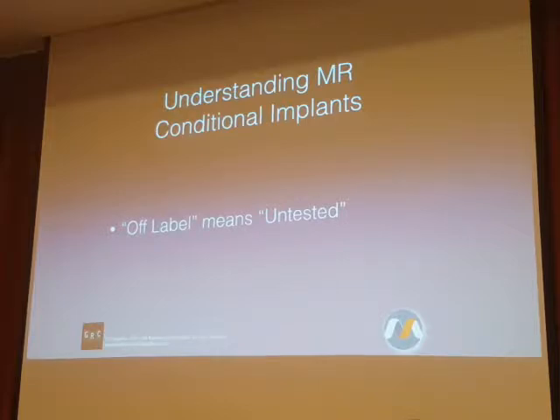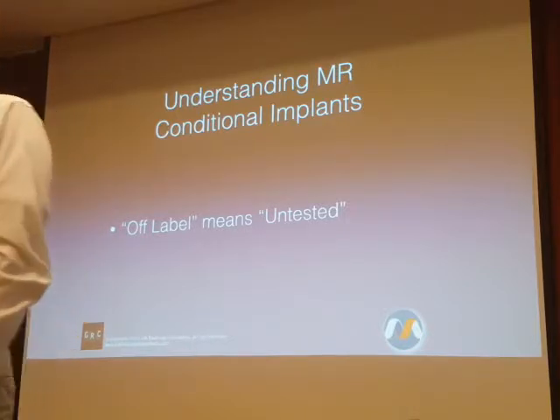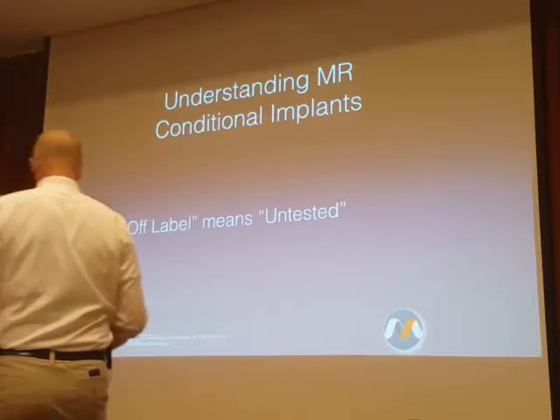The fact that it's out in the literature doesn't obligate the manufacturer to update their labeling and say, yeah, we had previously said 0.2, but now we see there's this research that says 0.5. We're going to upgrade our labeling. You can find that information in some cases for certain implants or devices. Doesn't change what the manufacturer represents as what they will stand behind.